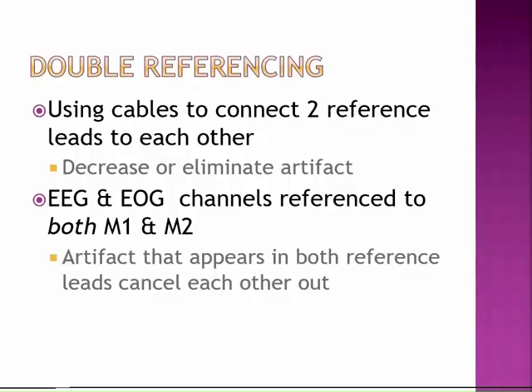There are other systems, though, that have to use what's called a jumper cable. It's an older way of doing it, but it's interesting. We still use them, where you physically tie M1 and M2 together. It's a little jumper cable you plug into M1 and M2, and there's a cable between them that physically ties the two together, so it combines the signal coming through from M1 and M2.